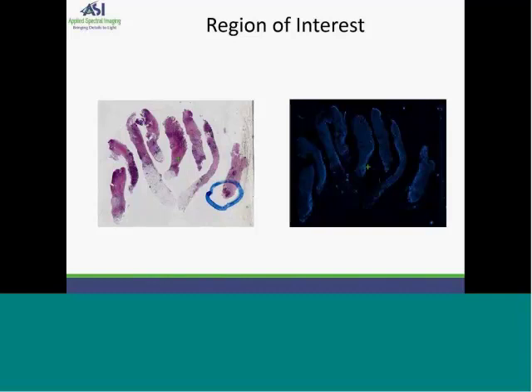While this concept of using an H&E sample to find the region of interest is not new, what we bring to the table is the ability to do all of this digitally. Our workflow takes a tiled image of both slides at 4x. Once there is an H&E at 4x, many times the pathologist can view the morphology of the slide in sufficient detail. But if 4x is not sufficient, the pathologist can always zoom into a 20x resolution. So we mark off the region of interest on the H&E, and that area is then automatically marked on the corresponding FISH slide. Once the FISH slide coordinates are known, the system can go immediately into scanning at 60x.